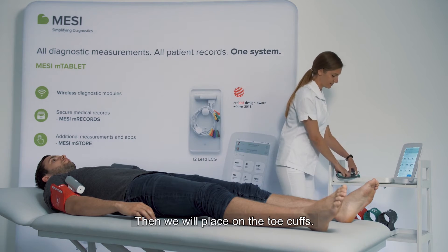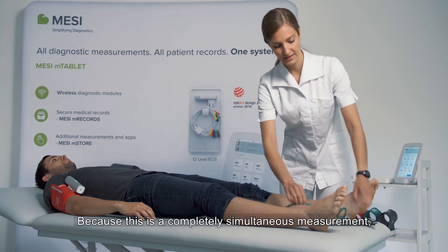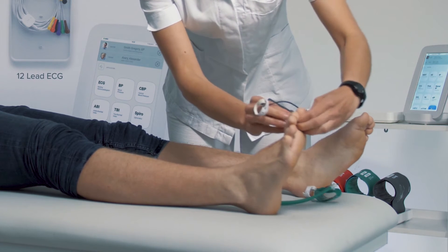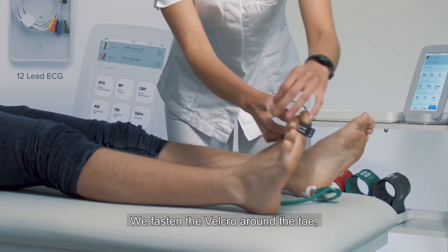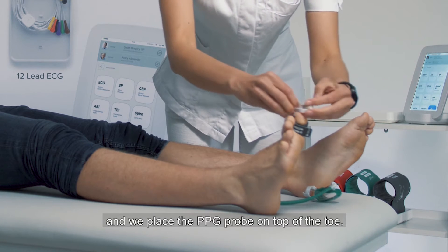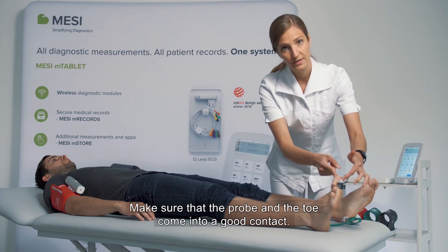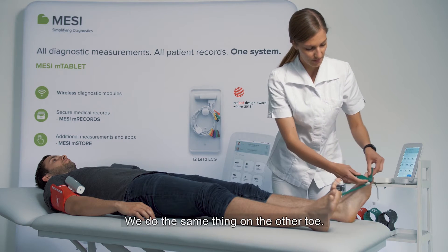Then we will place on the toe cuffs. Because this is a completely simultaneous measurement, we can place both toe cuffs at the same time. We fasten the velcro around the toe and we place the PPG probe on top of the toe. Make sure that the probe and the toe come into good contact. We do the same thing on the other toe.